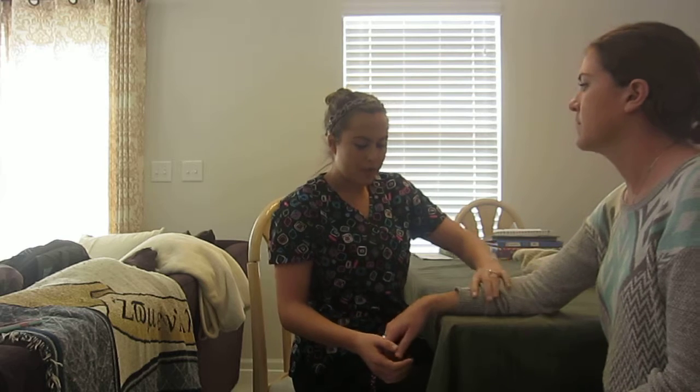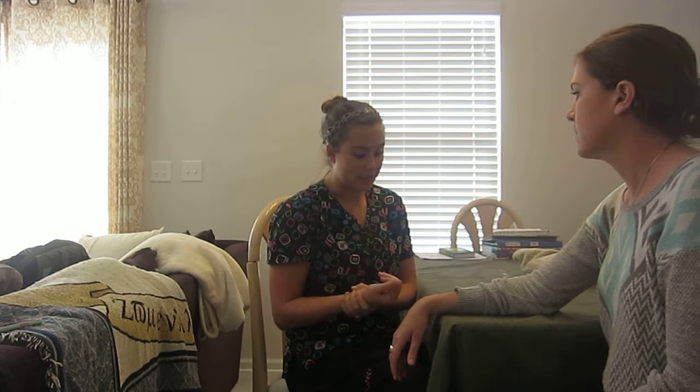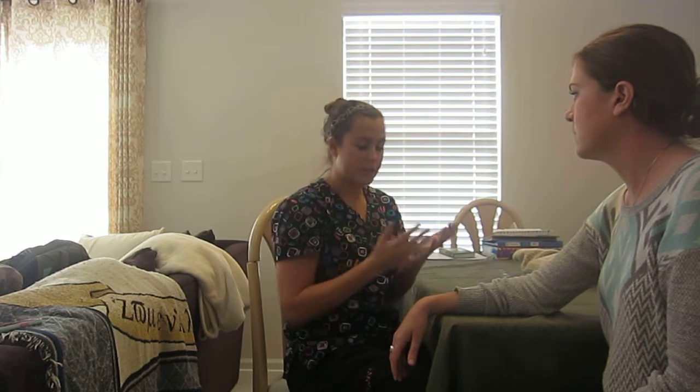Okay, so first thing that I want you to do is we're going to move your hand off the table. And we're going to do this actively and passively. Actively is you doing it on your own, and then I will do it passively to see if there's a difference in numbers.